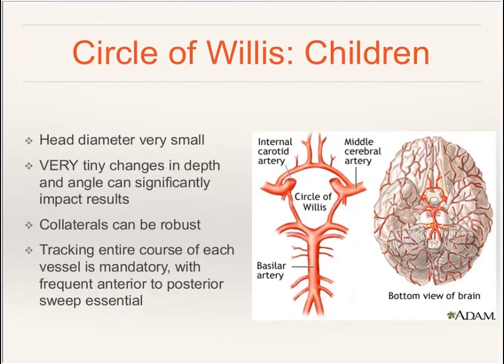On all the images that we show, it looks like the vessels are greatly divided by these communicating vessels and that they're very easy to evaluate. And in some patients, they are. But when you think about how close lying these vessels are to one another, a very small movement of the position of the Doppler sample volume, either anteriorly or posteriorly or inferiorly, can actually change the vessel that you're insonating.